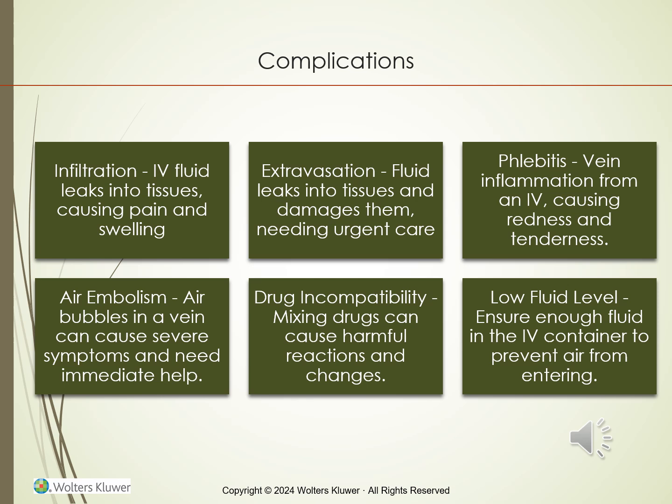An excessive infiltration would be like a very large amount of medication being administered into that area at a specific time.